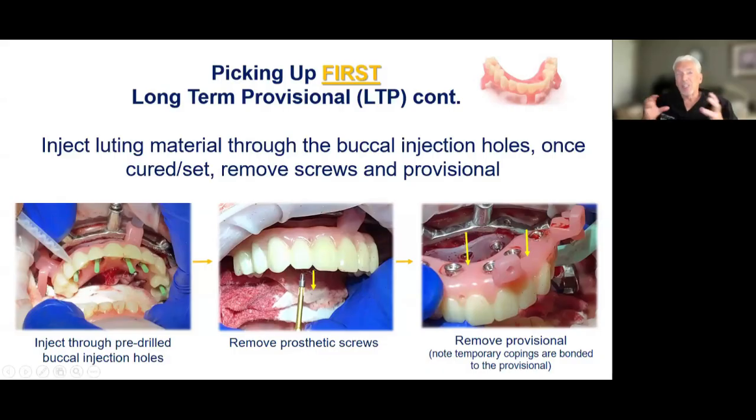So you hit it with the light to really set it, but dual cure is nice because light cure, based on what unit you're using, maybe doesn't penetrate deep enough in some of the areas, and nothing worse than you start removing a prosthesis and you get this stringy acrylic and your temporary coping stays there on the MUA. Oh man, that's no fun. So I like dual cure material for that purpose.